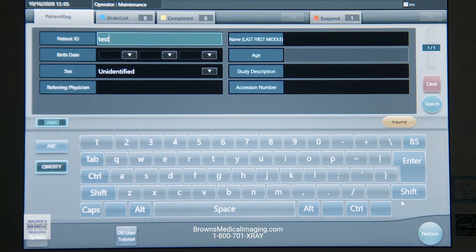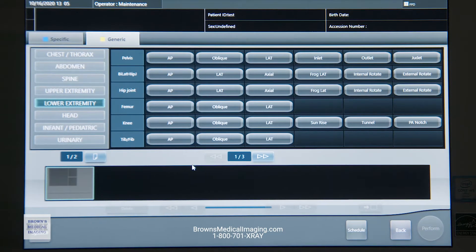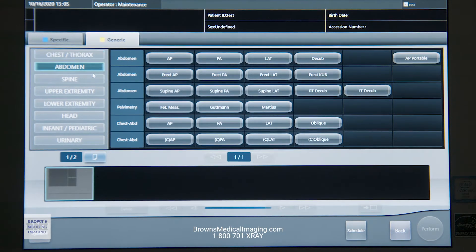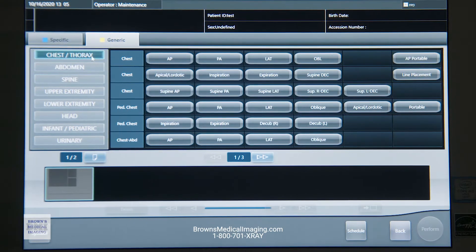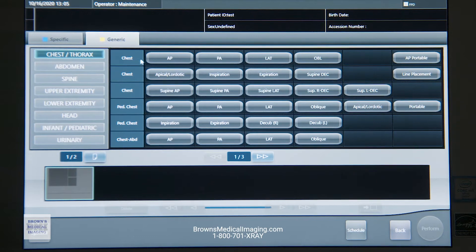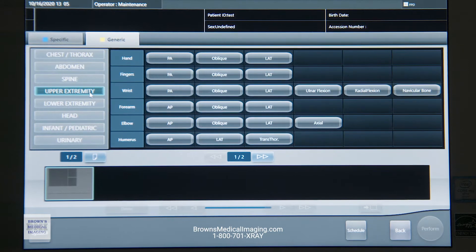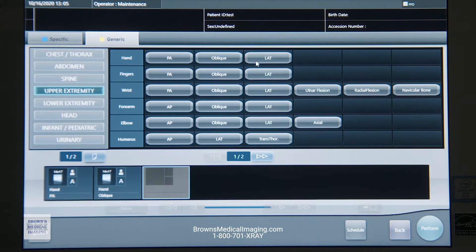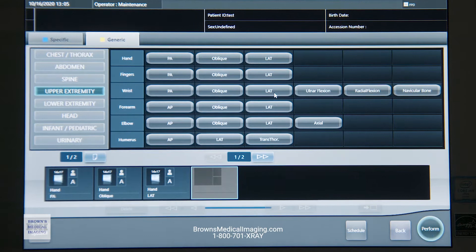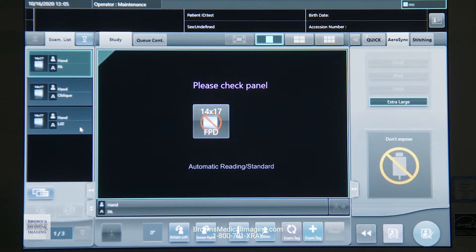Say that's a test patient. We're going to perform that study, and if we're manually registering patients, we're going to select from the exam tag palette what we are shooting. We've got our body regions on the left-hand side. Within each body region we've got our anatomy, and further to the right we've got the views for each piece of anatomy. So if we're doing a hand, we go to upper extremity, hand, PA, oblique, lateral — it adds them down at the bottom.